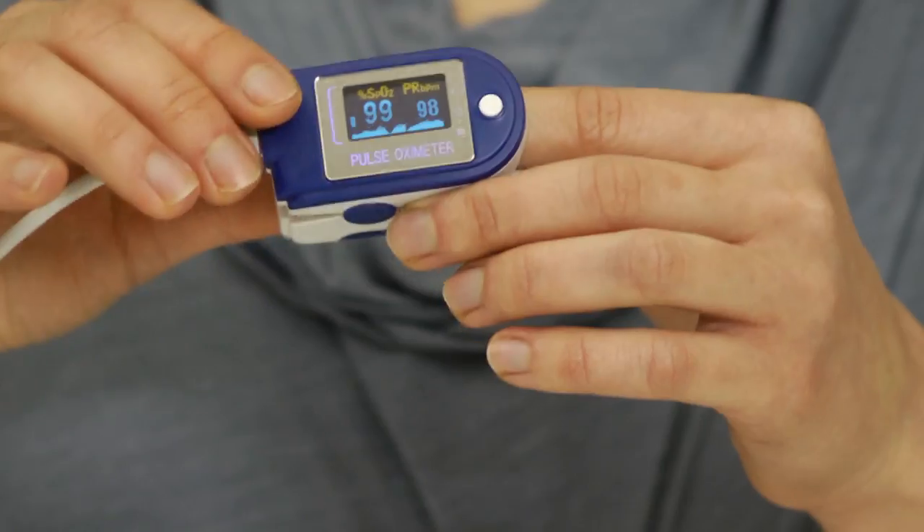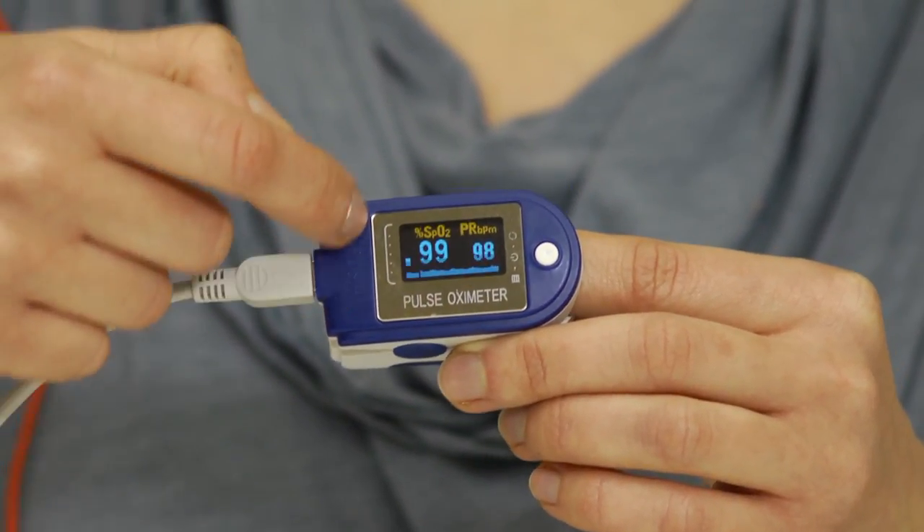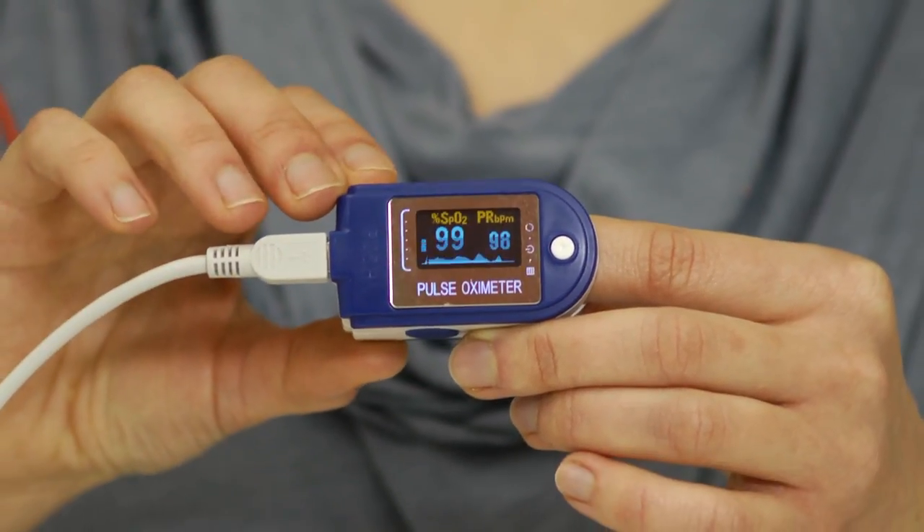Both of these methods are good for measuring heart rate and pulse, but this device also provides us with the blood oxygen levels, which we see here on the side.